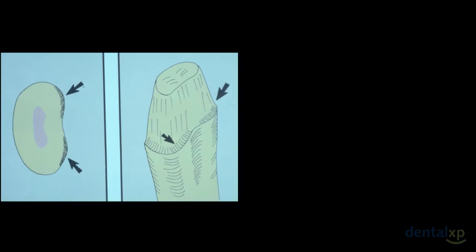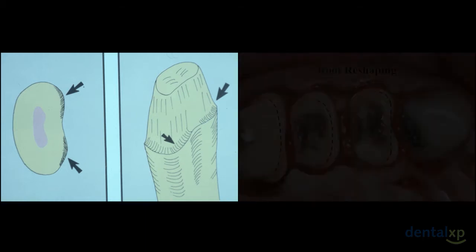This is a photograph taken from Dr. Howard Kay's article in 1987. But if you look at it, particularly the occlusal view, and see the darkened areas, we're going to work on the line angles and remove those dark areas. If you look at the arrows and dark areas, that is where we want to work to correct the concavity. Certainly when you do biologic shaping, you need to remove all CEJs, so you would have to work slightly in the area of the concavity, but not aggressively.